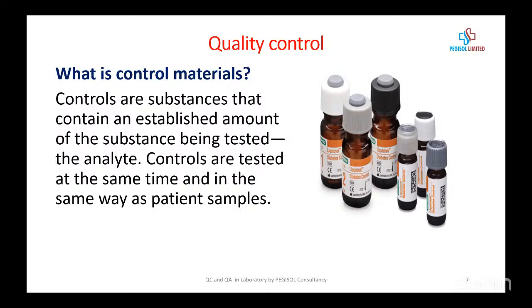The control is tested at the same time and in the same way as a patient sample. Does that make sense? So the same way you test the patient sample is the same way you should test the control. The control should not be done by a specialized person or one person while somebody else is doing the patient sample.